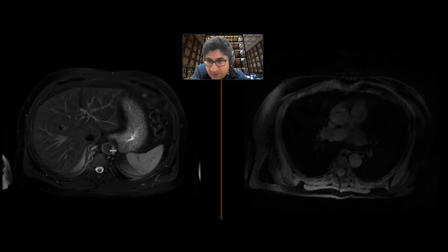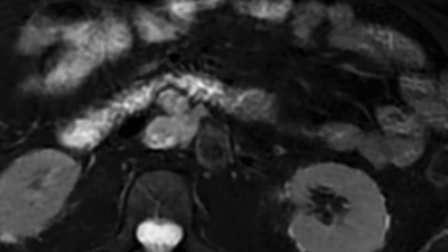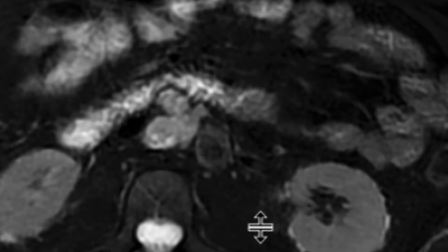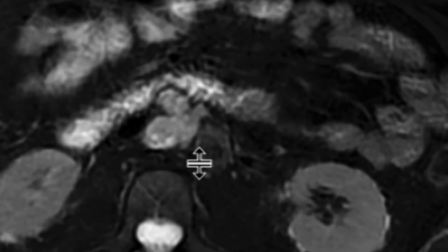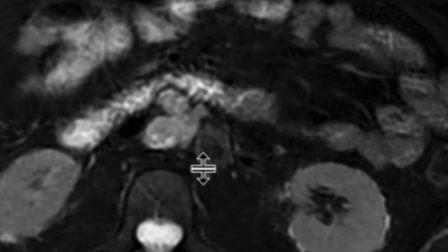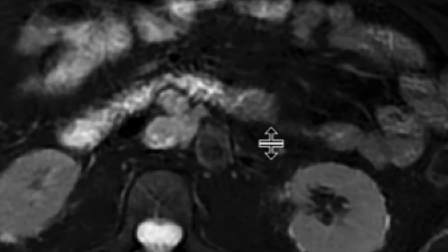This is a T2-weighted sequence. The abnormality is in the retroperitoneum. We can see this is the aorta, this is the IVC — the distal aspect of the aorta — and there is a relatively T2 hyperintense mass sandwiched between the aorta and IVC, with lobulated borders. It's unclear if it's one mass or a couple of masses adjacent to each other.